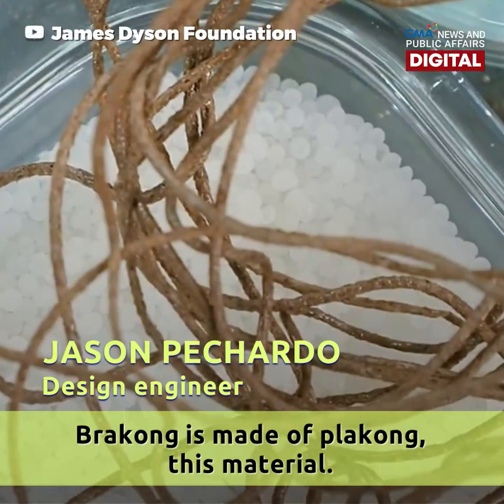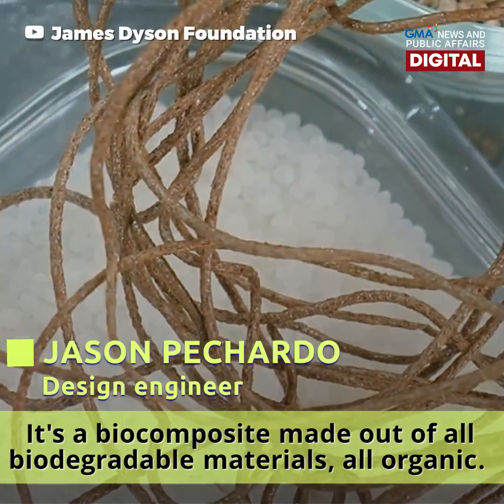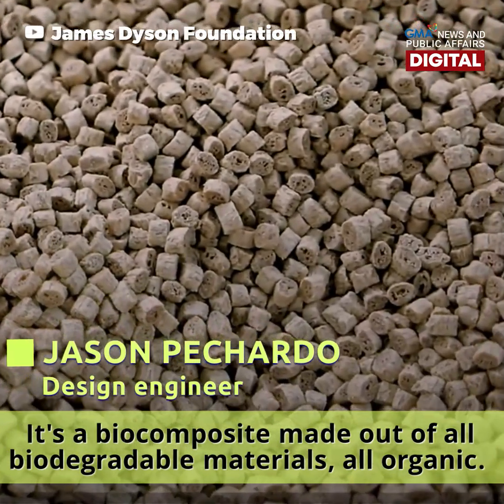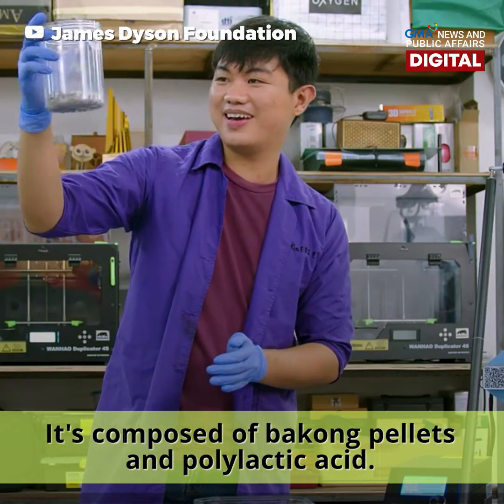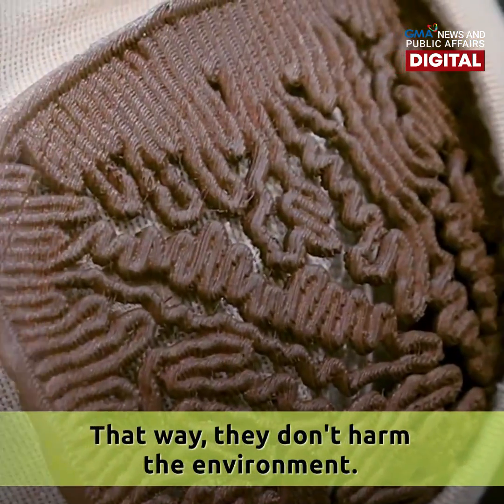Brakong is made of this material — a biocomposite made out of all biodegradable, organic materials. It's composed of bakong pellets and polylactic acid, so that way they don't harm the environment.